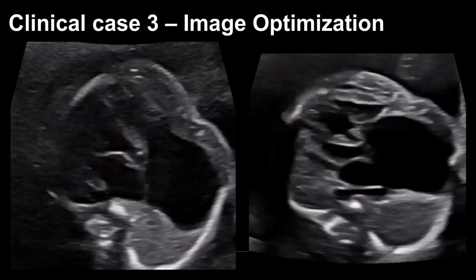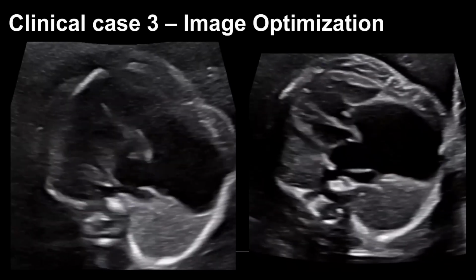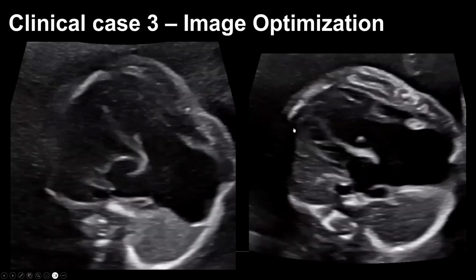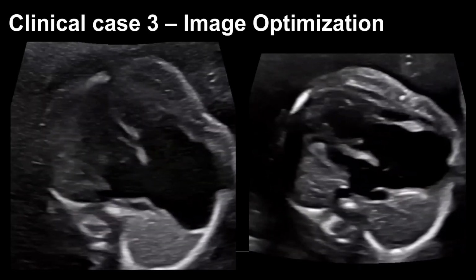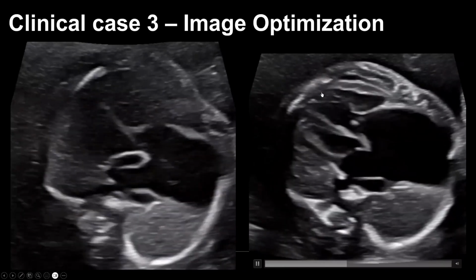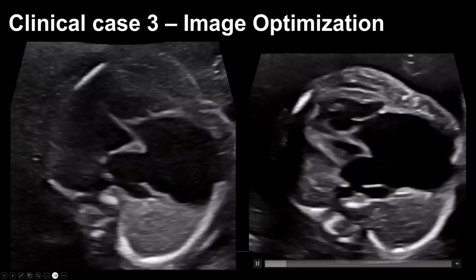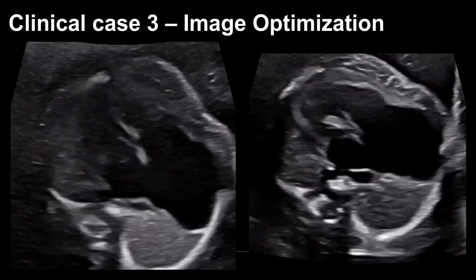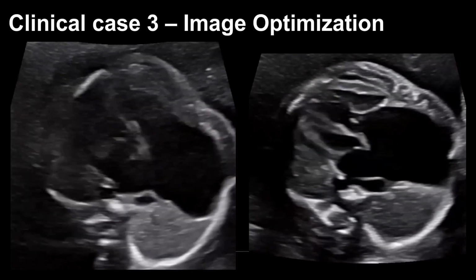But I just want you to make sure that you never give up to improve your image and do it first and then try to interpret, because the application of all these techniques, including the speckle reduction, so the clear vision, the HD vision, the appearance of the 2D image as the 3D, which is the luminant technique.